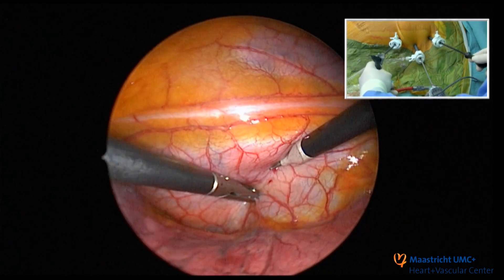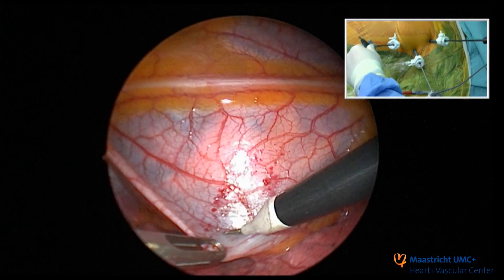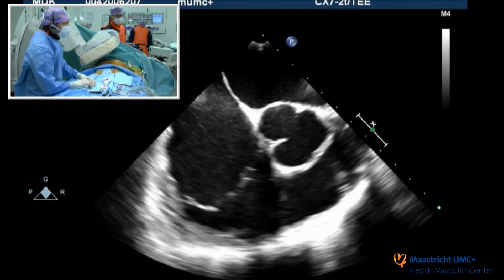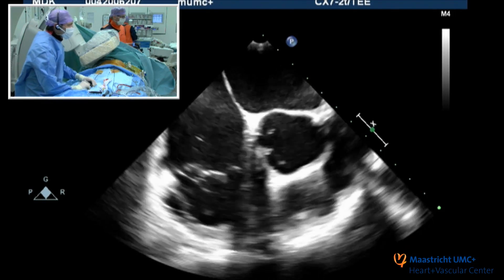You need two teams in the hybrid room: the cardiology team and the surgical team. The first step of the procedure is the epicardial approach — the approach on the outside of the heart. With a camera, we go inside the chest and make certain ablation lines on the left and the right atrium. Afterwards, when these lines have been created, the cardiologist goes in and maps the lines and, if necessary, continues the lines from inside, checking if the lesions made by the surgeon are complete. If those lesions are incomplete, we can perform an endocardial touch-up.